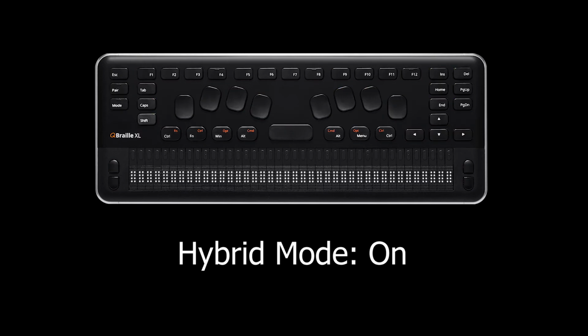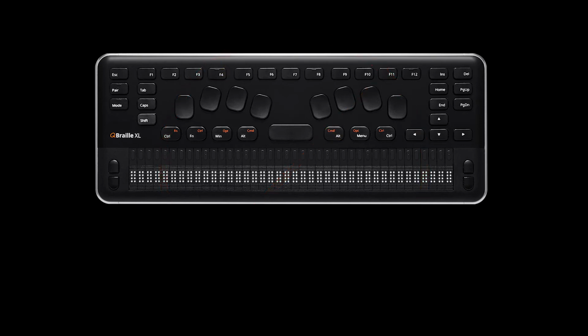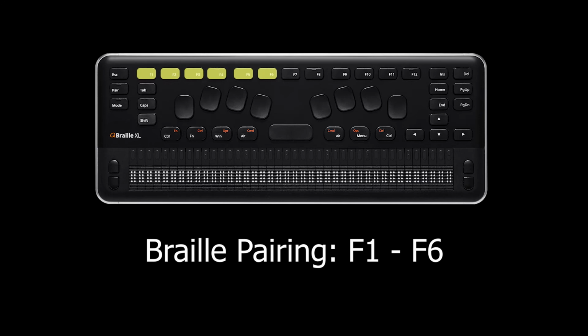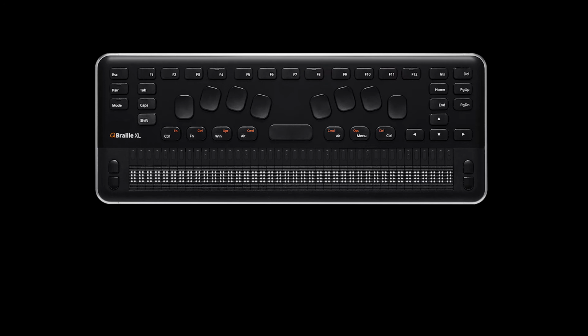To illustrate, when hybrid mode is turned on and you want to close an application, you can press Alt with F4. With hybrid mode off, this keyboard command just won't work. The QBraille uses the function keys on top of the Braille display for Braille and QWERTY pairings. For Braille pairings, use F1 through F6, and for QWERTY pairings, use F7 through F12. Each function key is tied to a device so that you can easily switch between devices. That means if you've already connected the QWERTY part of your QBraille to another device, then the F7 pairing slot is already taken. Alright, back to setup.